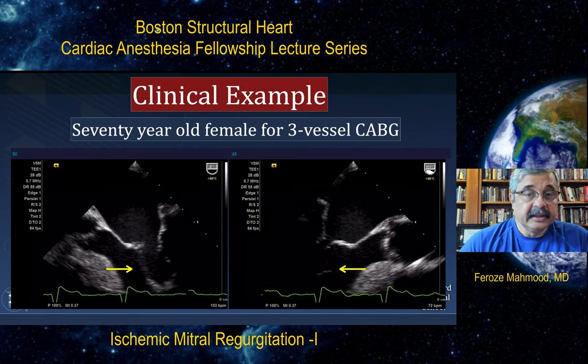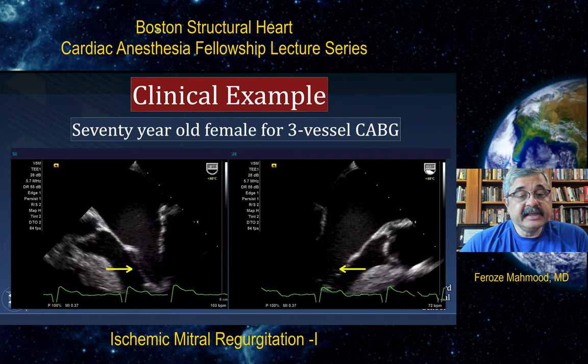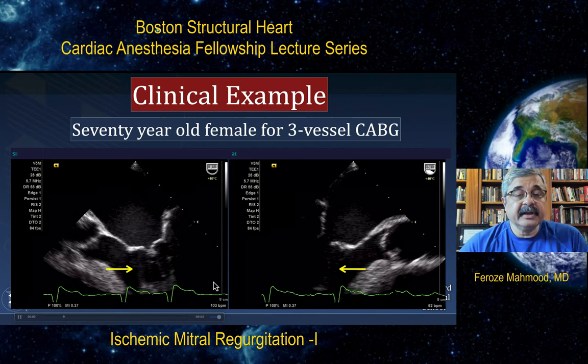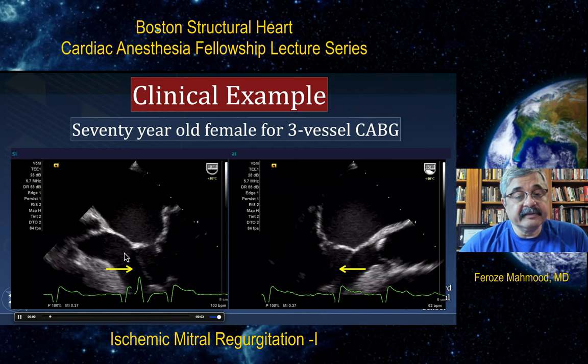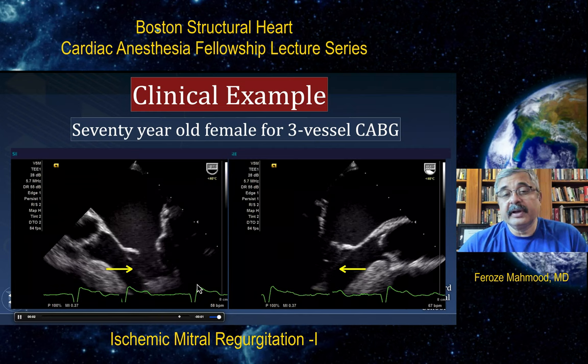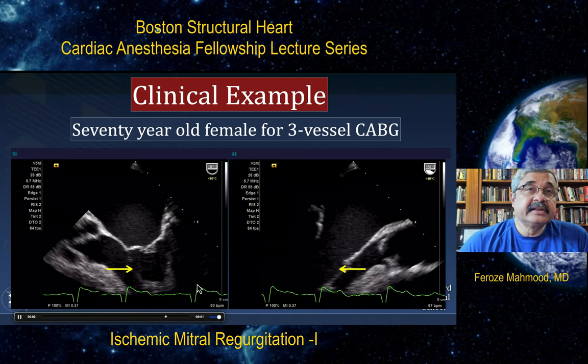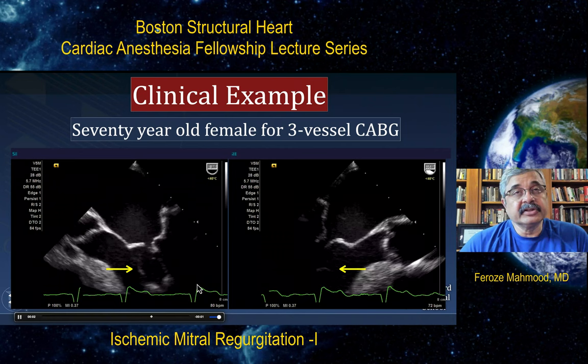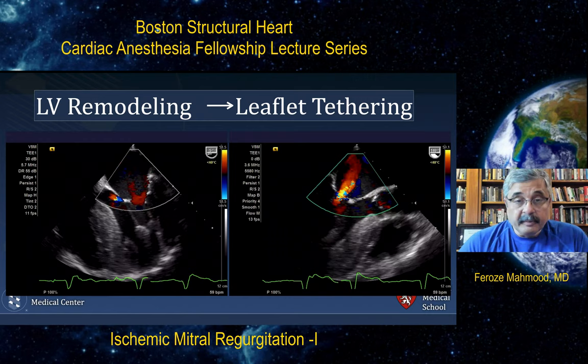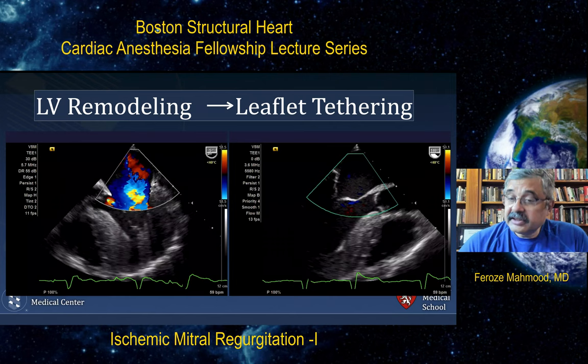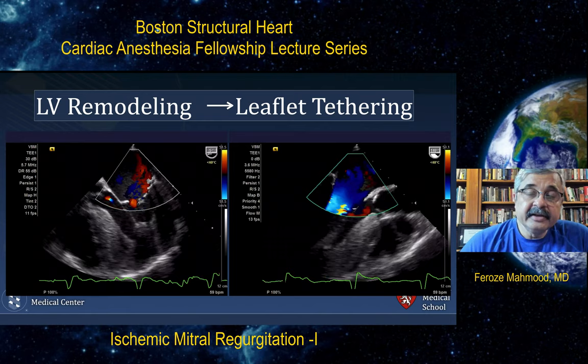Another clinical example is a 70-year-old female for three-vessel CABG. You can see these tethered chordae tendineae pulling the leaflets more towards apical displacement, and particularly a chord attaching to the belly of the anterior leaflet, leading to the classical seagull appearance of the anterior leaflet — also known as the seagull sign — which is quite indicative of significant adverse remodeling and tethering. This is left ventricular remodeling leading to an imbalance between closing and tethering forces, causing significant tethering of both anterior and posterior leaflets and central mitral regurgitation.